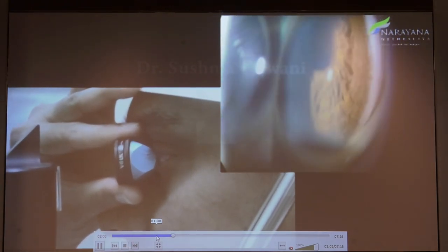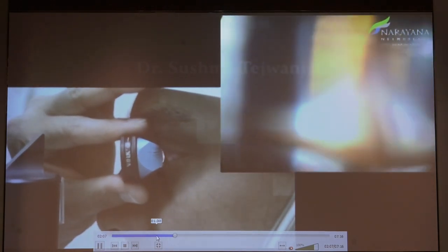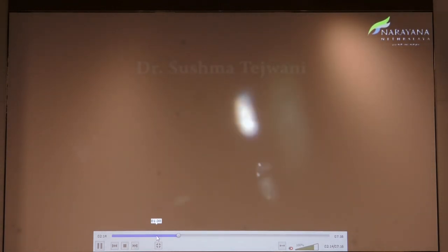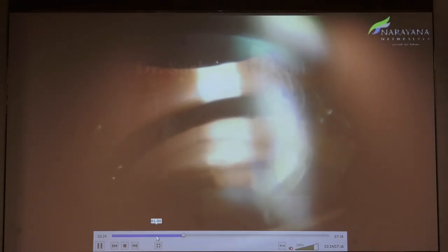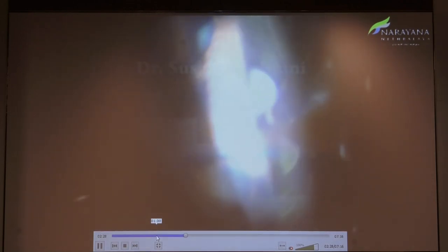The ideal technique is to keep the room light off with a small beam, so as to understand the angle in its physiological or scotopic state. After that, increase the light. If you don't reduce the light first, your angle would appear artificially open. The video was taken with increased light to show the view — but the correct technique is to look at all angles under dim conditions.